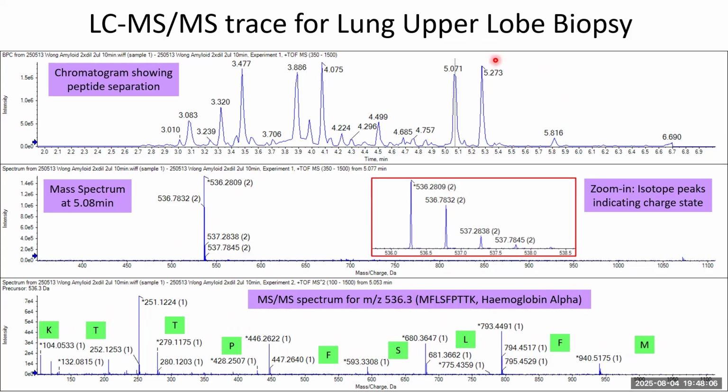And so you can see in this lung biopsy, it's actually been one of the more abundant signals in the sample. So I dare say all of these prominent peaks actually came from hemoglobin. And our task is to look beyond that and try and find those amyloid signals that will be further down the list, hiding in the smaller peaks in this chromatogram. So yeah, blood is a bit of a problem for us, but sometimes in the biopsies we have to go where the blood vessels are, which is where the Congo red staining was. So we can't often escape from this particular issue.